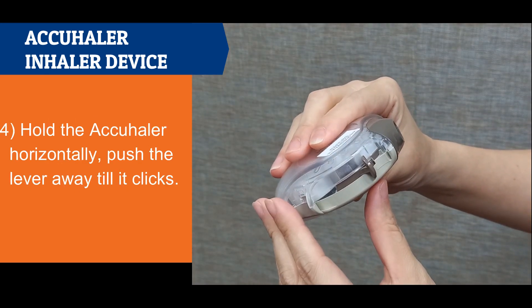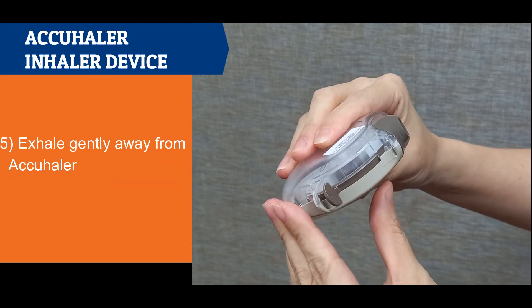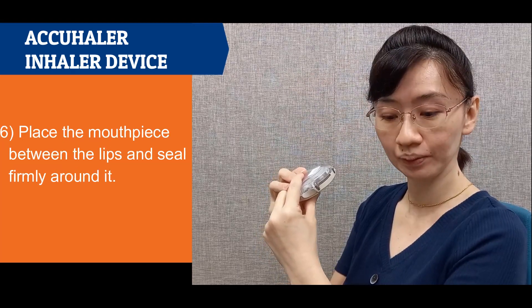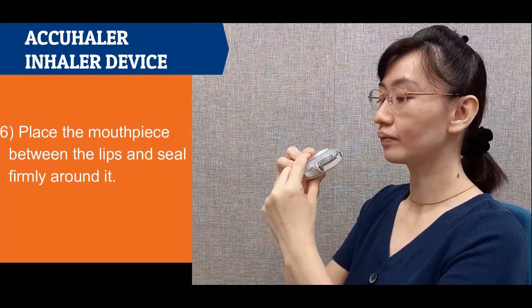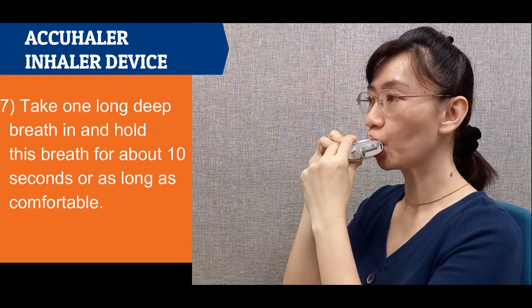Hold the accuhaler horizontally and push the lever away until it clicks. Exhale gently away from the accuhaler.